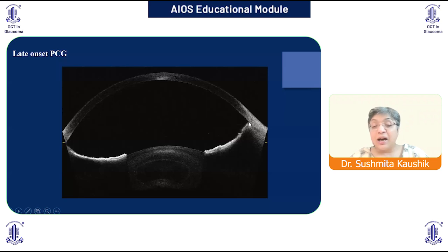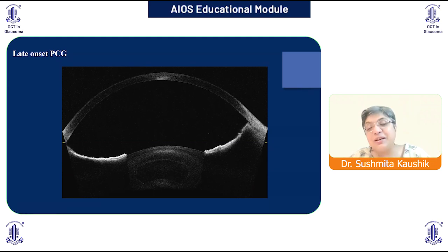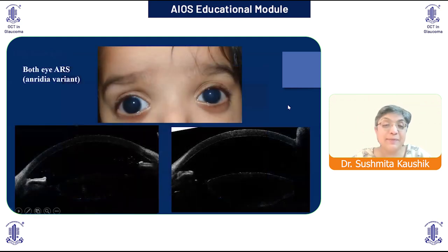Here you see this high iris insertion and a concave iris configuration. This is what we see on gonioscopy. So there's no great shakes that the AS-OCT is telling us, but it's nice to show the patient an image and see for ourselves that this is what high iris insertion really means. And as the eye grows, because the iris is inserted high, it falls back on the lens like a little hammock. And this is the concave configuration that we see in JOAG or late-onset PCG.